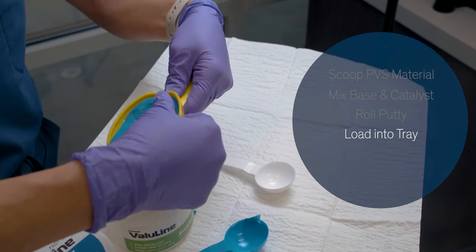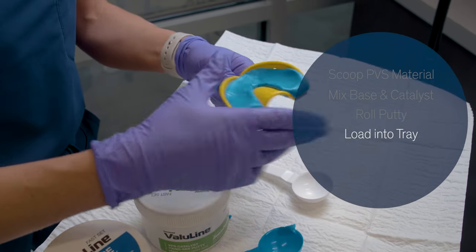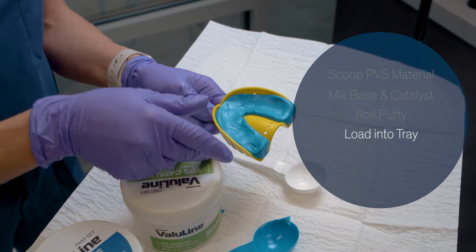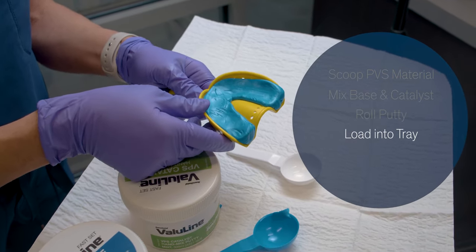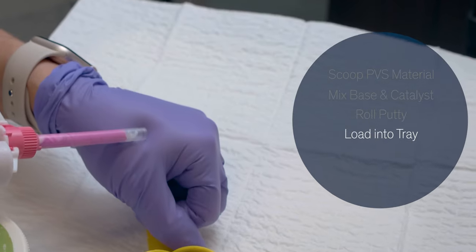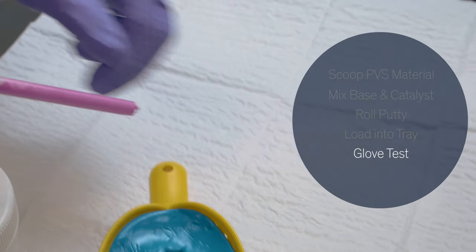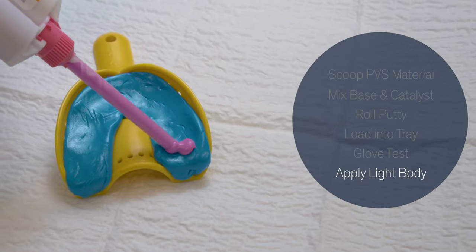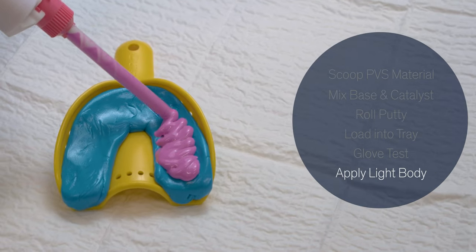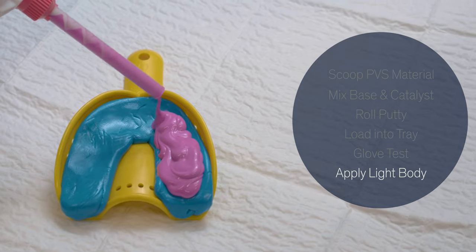Push down a little bit to make a well to add your light body PVS material on top, and then you will be able to seat this in the patient's mouth for your impression. Always bleed a little bit of light body material on the back of your glove, and then apply the light body PVS material on top of the putty.